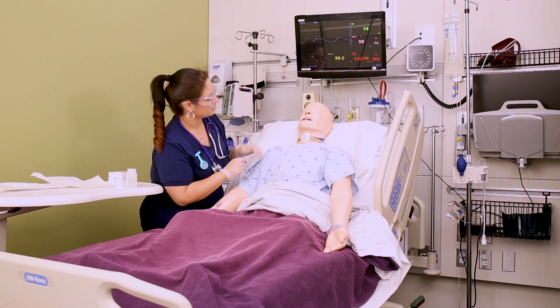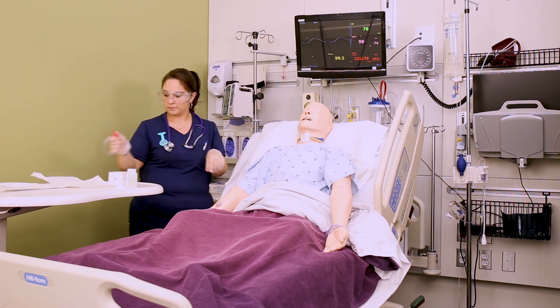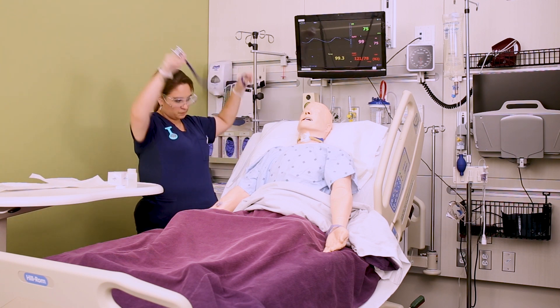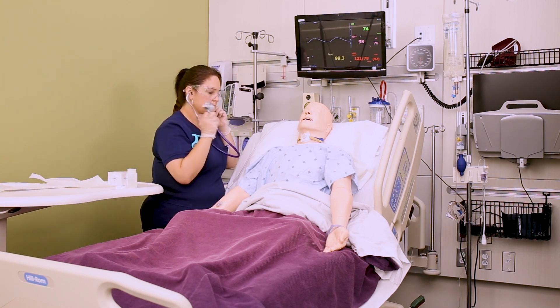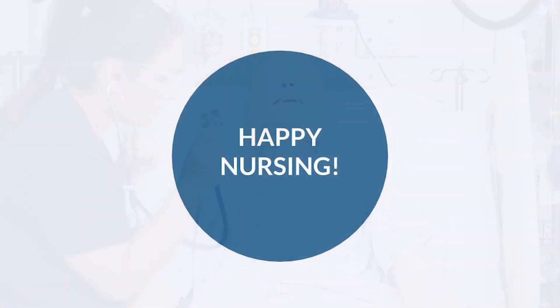When you're done you can wrap it up in your hand. Make sure that you see the patient's oxygen saturation has improved, and you always want to listen to their lungs again to make sure that you've actually made a difference and gotten the secretions out that you wanted.